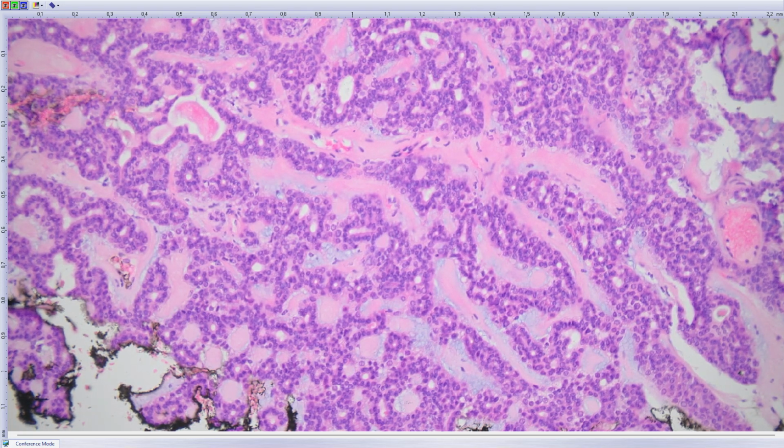Yes, canalicular adenoma is a benign salivary gland tumor, which is typically seen in the lip. However, it has been described also in the palate. So this is canalicular adenoma, and I supported my diagnosis because of this discrepancy in the opinions of two pathologists. I had the help of molecular testing. So we have negative fluorescence in situ hybridization for HMGA2, negative for PLAG1, and more importantly, negative for MYB.